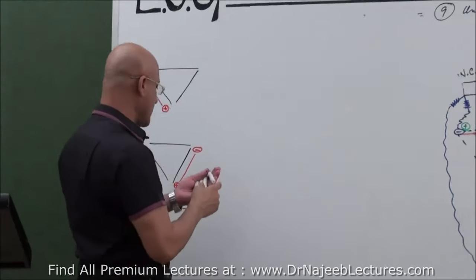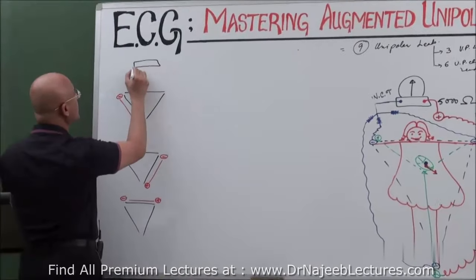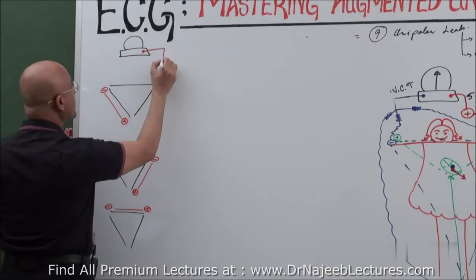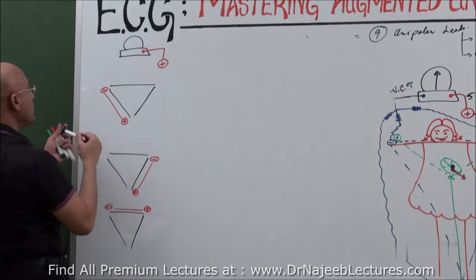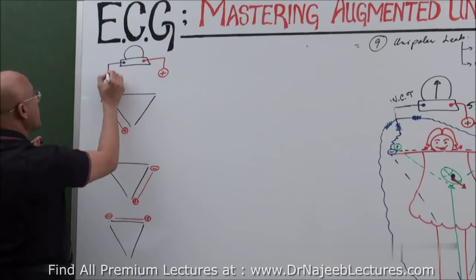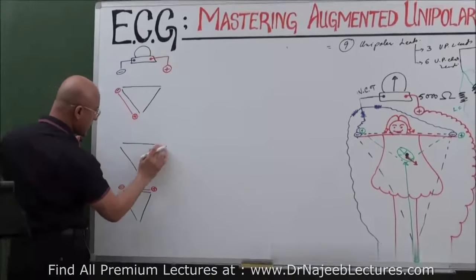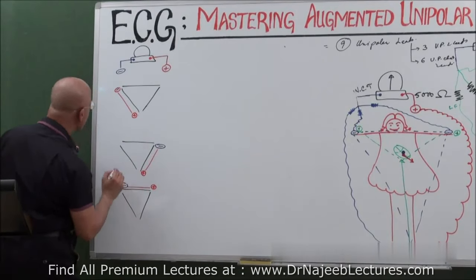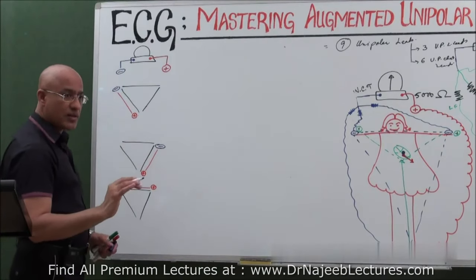Now we come to another arrangement. In this case, our machine was this arrangement. One pole was always positive. Other pole was always negative. Clear? Yes. You have a question?